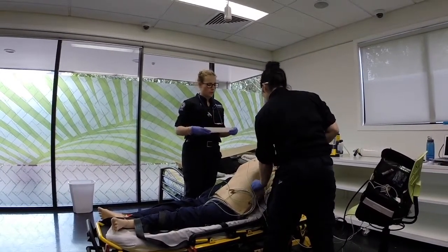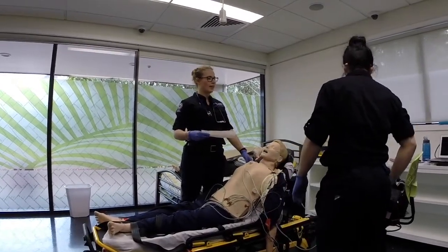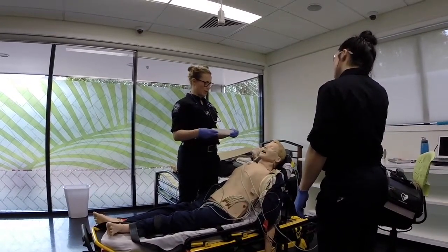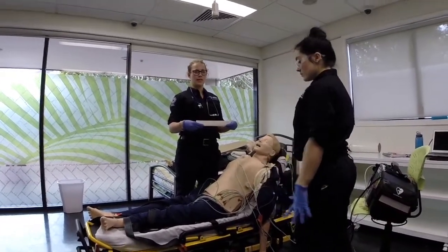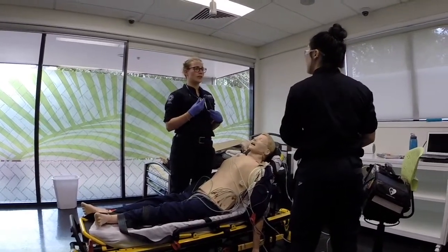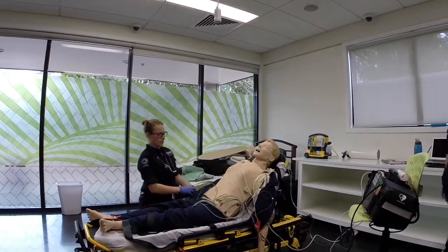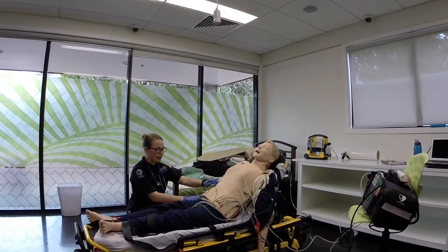And so Bob, what we want to do is your heart's beating a little bit too fast, so we kind of want to electrically fix that. Is that okay? Is it gonna hurt? Yeah, it will hurt, but I will give you some pain relief to help that, and it won't hurt then. And that should stop the chest pain? Yeah, that will definitely stop the chest pain. Cool. So if you can please draw up the fentanyl, and I will get an IV line in. Perfect, thank you. So for the purpose of the assessment, an IV line has already been put into his arm.